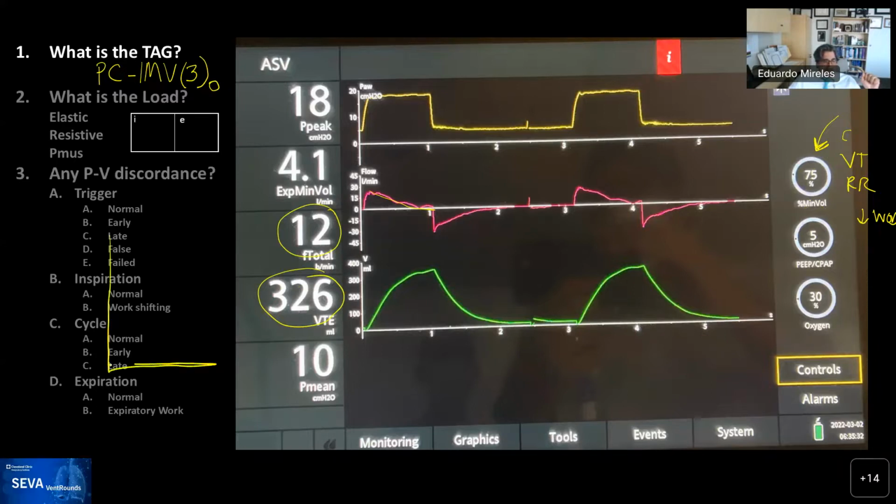Actually, if you imagine this is a graph, that's a terrible line, but just forget about it. So here you're going to have tidal volume, and here you have respiratory rate. And if you graph work of breathing, it looks more or less like that. And so what the machine is calculating is a respiratory rate and a tidal volume at which you are using the least amount of work for it. That's the optimal part. And it does that for the mandatory as well as the spontaneous breaths.